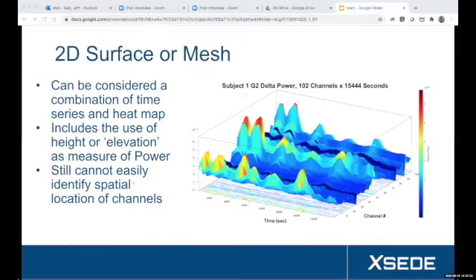But one interesting thing about this method, at least in MATLAB, is that our heat map is also a 3-dimensional mesh, and we can rotate it and tilt it to a bird's eye view. And this is equivalent to merging the time series plots with the heat map. In other words, the vertical peaks are analogous to the time series we viewed earlier. So we're also using color and elevation to represent values of MEG power.